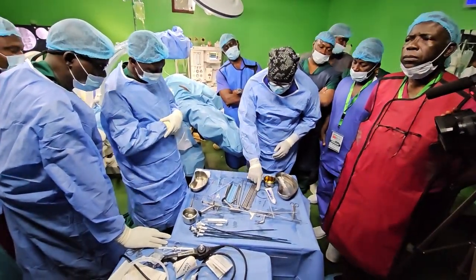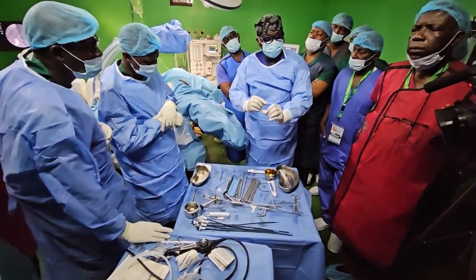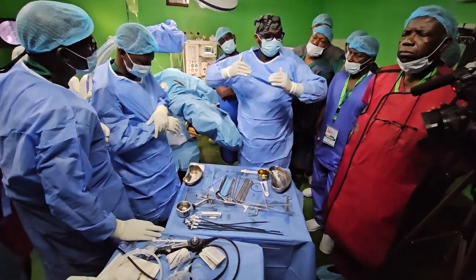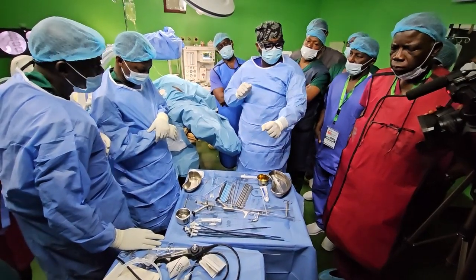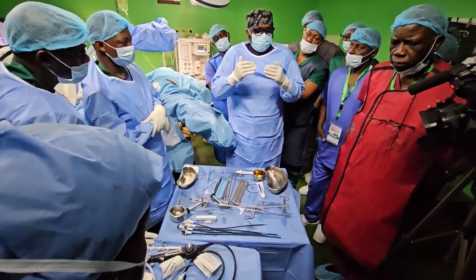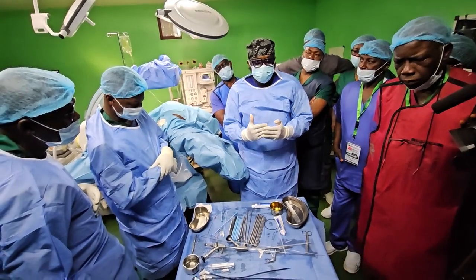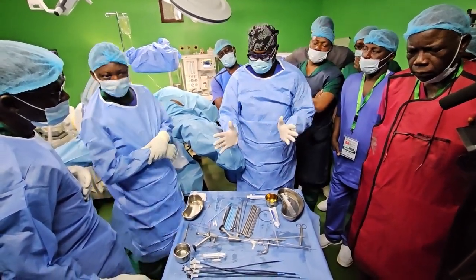dilators serially over it. The advantage is, the first one goes in, the next one goes in over it, tamponading the kidney. Serially like that, it goes in over it. You are not removing the previous one. So by the time you are through, the kidney is already tamponaded, your point of entry is tamponaded. So you discover that your field is clear and clean, and you are just doing your procedure neatly.